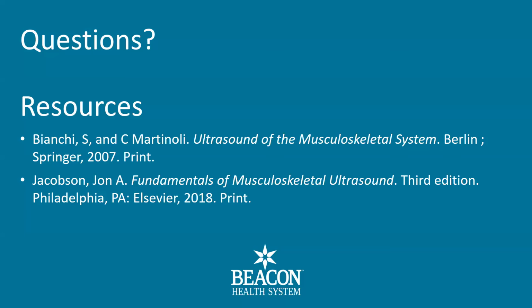Hey Doug, this is Brennan. Yeah, this is a great case. I think my findings would echo what you guys have both said. Hardware is the number one reason I see actual abnormalities here. The second, I've seen a couple of patients with RA who will get a true Pes bursitis.